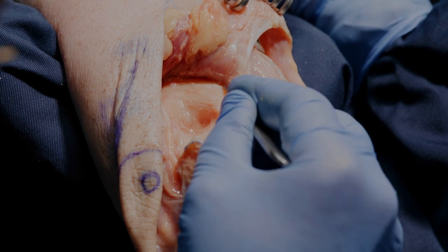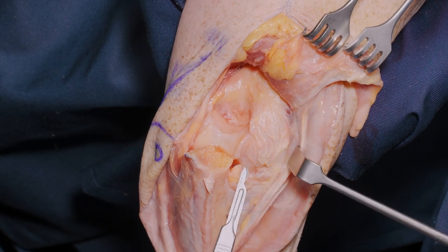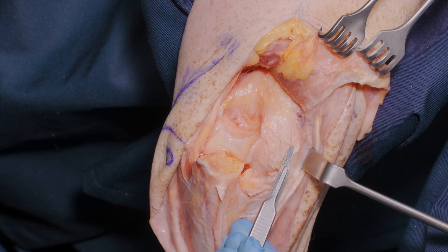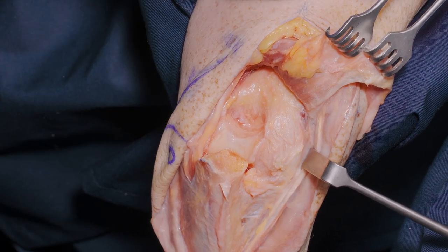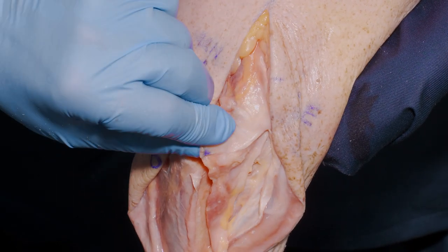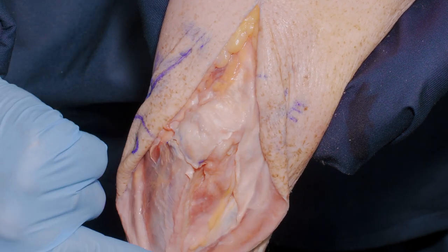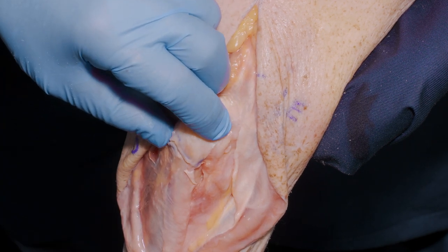We now have an excellent view of the lateral column and capitellum, sufficient to fix a low transverse, relatively simple fracture of the lateral column. When replaced at the end of the procedure and the triceps returns to its normal position, our reconstruction is of the antebrachial fascia, which restores continuity and therefore stability to the joint on the lateral column.